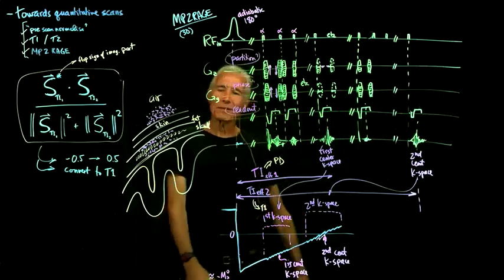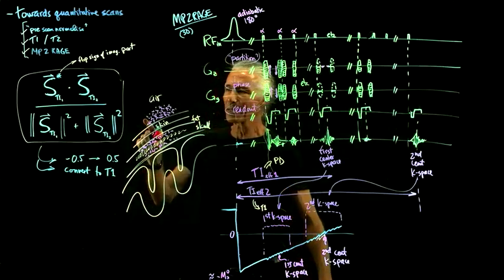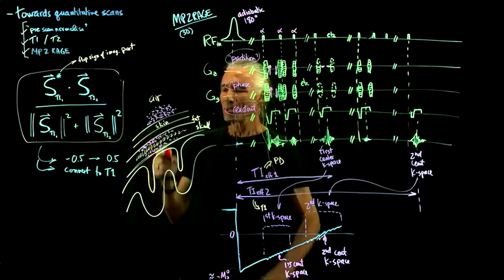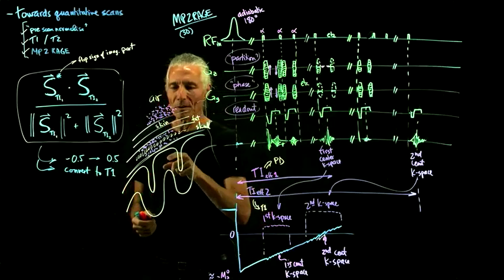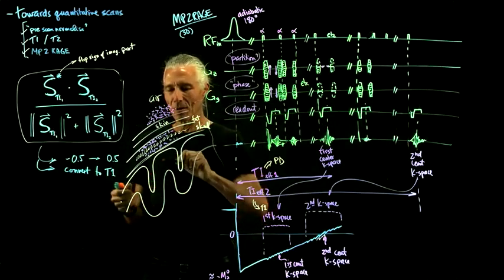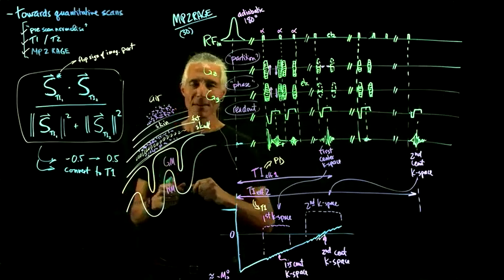So there are various problems with it because we have these low signal to noise areas that generate noise. But in general, if you're trying to segment gray from white matter, you're going to do a better job because these will be real numbers that don't vary across the brain.